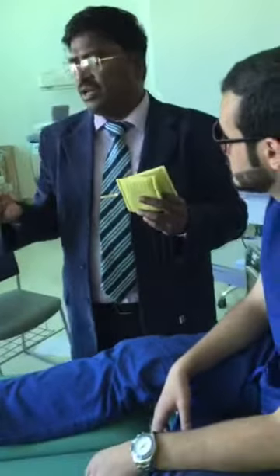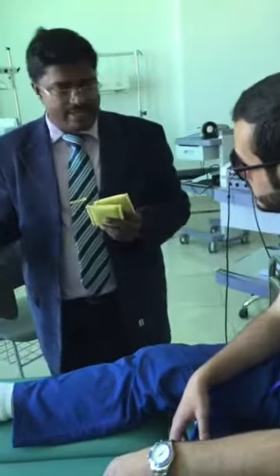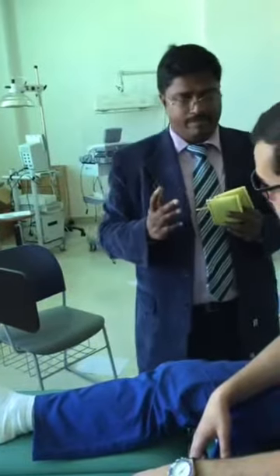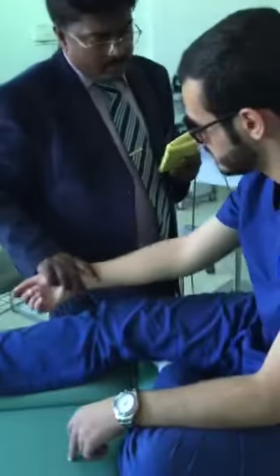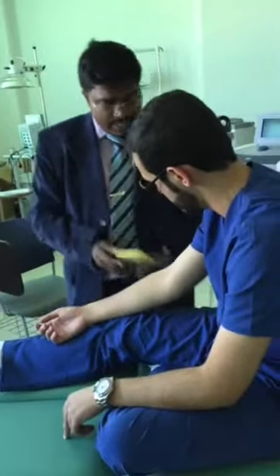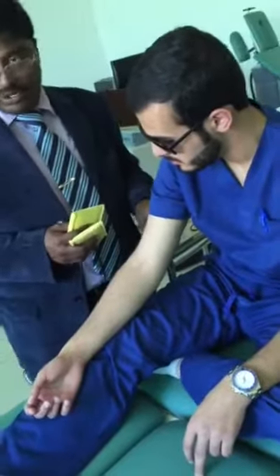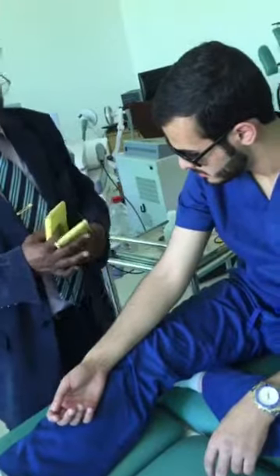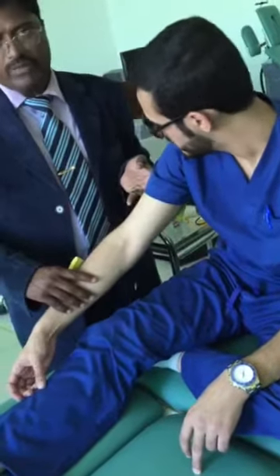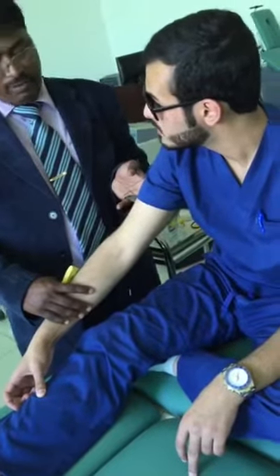Another type is nerve pain application. For nerves such as the radial nerve, ulnar nerve, or median nerve, if a particular nerve is causing pain, you keep the electrodes where the nerve is superficial. For example, for radial nerve pain in the upper limb, the radial nerve is superficial at the radial groove. You keep one electrode on the radial groove and the other electrode on the dorsum of the forearm — these are the two places where the radial nerve is superficial.